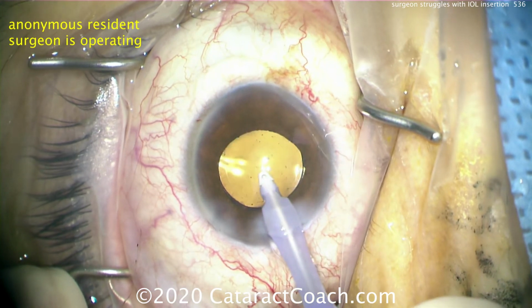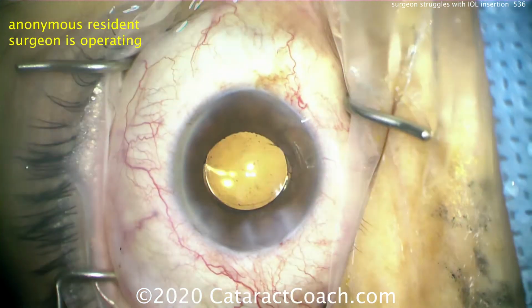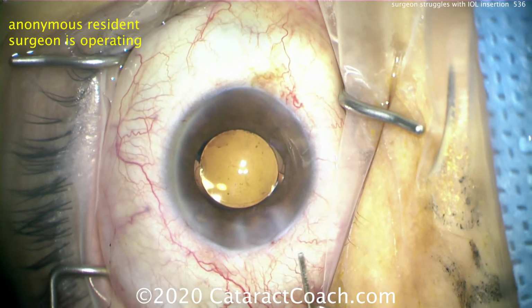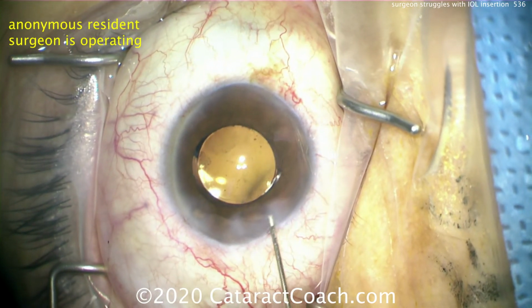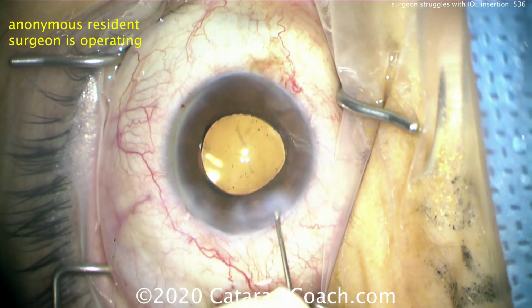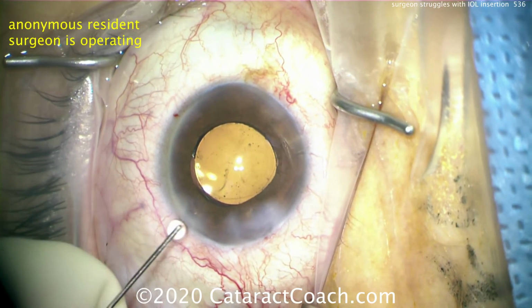Now look, the lens stays centered. So if your lens is getting decentered every time you seal the incision or take out viscoelastic, that means it's not fully in the capsular bag. And you need to go back inside and get that lens positioned. Do not leave the lens in the sulcus.